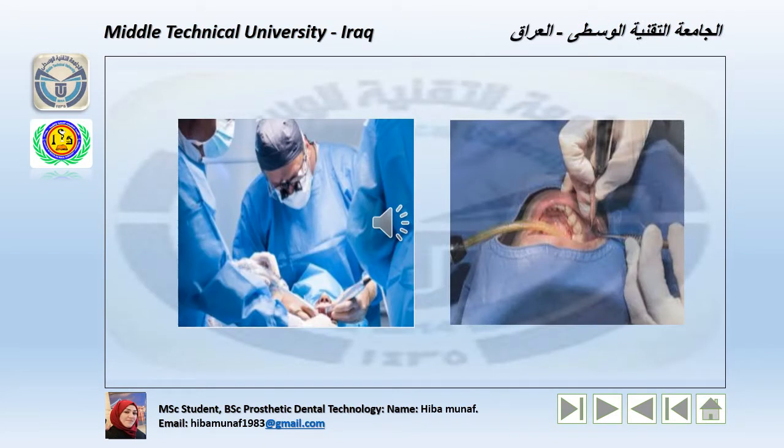In the surgical approach, most dental implant surgery procedures are performed in the dentist practice or in the hospital setting. Local anesthesia is adequate enough to complete the procedures.